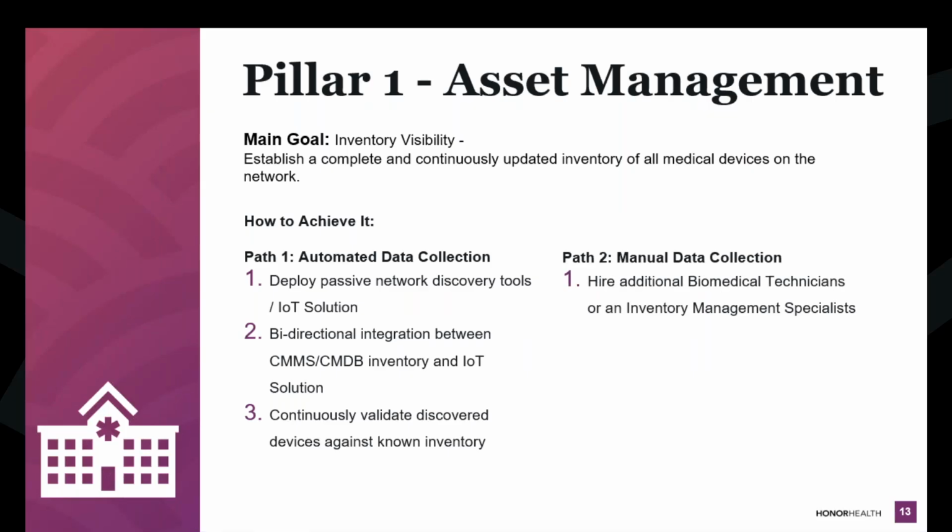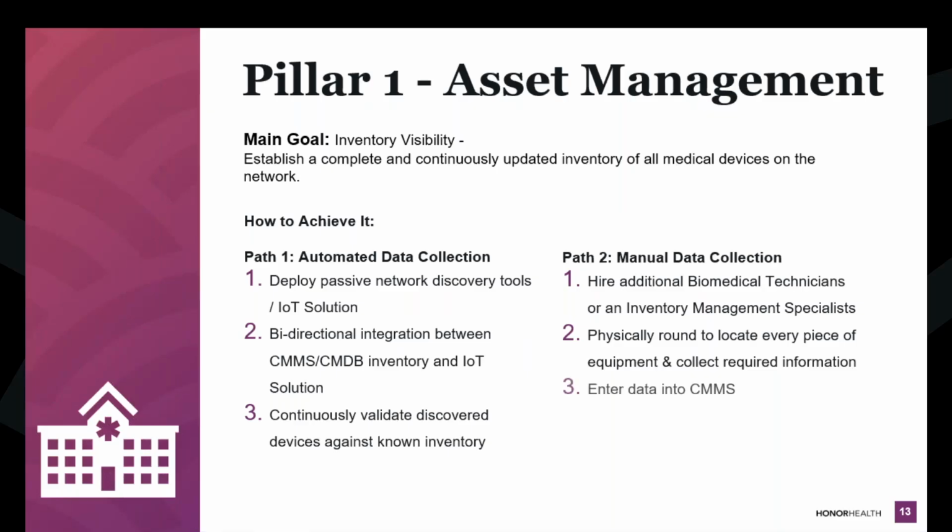And then for the manual data collection, first of all, if you're really set on doing this manually, you're going to have to hire someone. It's either an inventory management specialist, consultants. You can hire additional biomeds because it's a lot of overhead, a lot of tracking, a lot of writing things down, right? Your biomed or your inventory management specialist is going to walk around the hospital room to room, look at every piece of equipment, track it, write it down probably on a notepad somewhere, go back to the desk, enter that data into the CMMS.